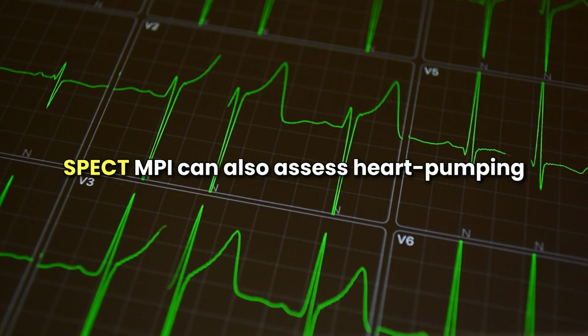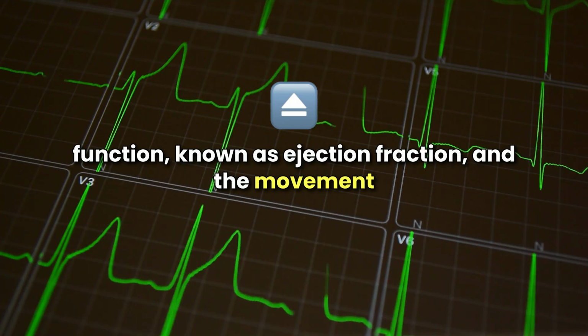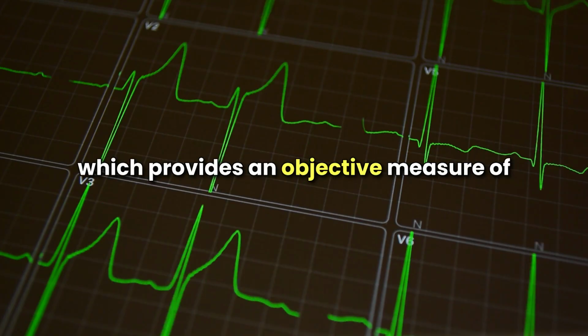SPECT MPI can also assess the heart's pumping function, known as ejection fraction, and the movement of the heart walls, known as wall motion. This helps in evaluating the overall function of the left ventricle. Quantitative analysis involves calculating perfusion scores, which provide an objective measure of the extent and severity of ischemia.